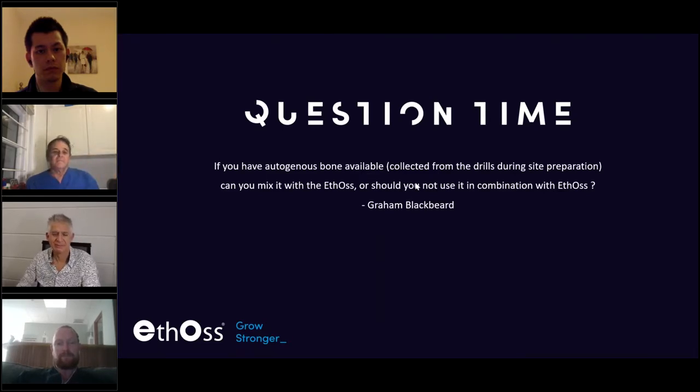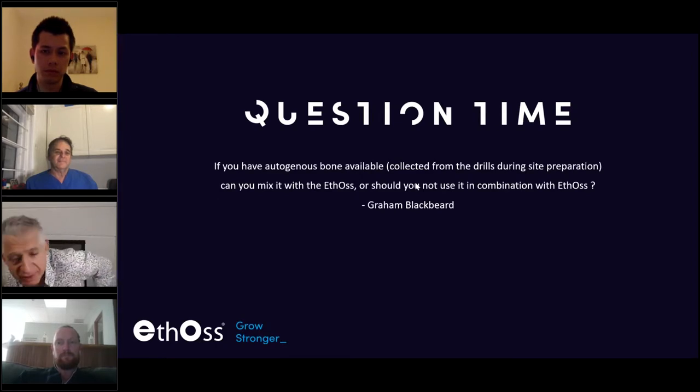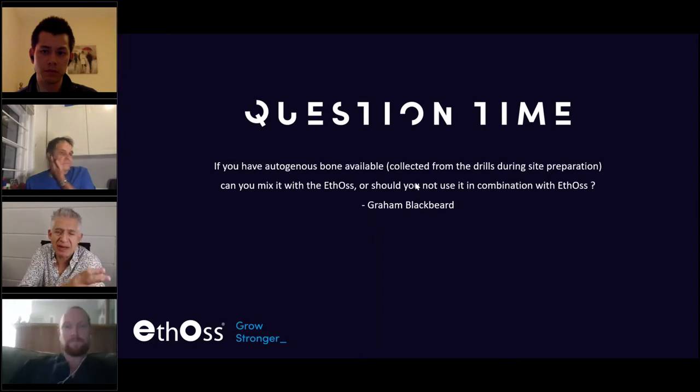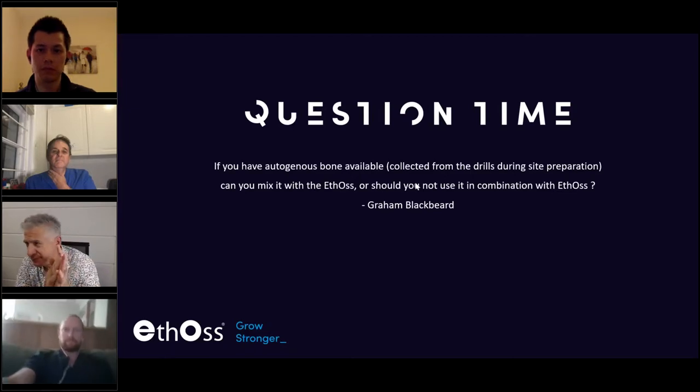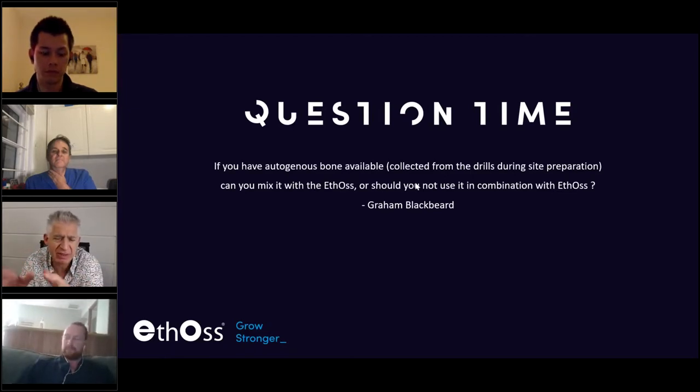So moving on to the next question. How many Newton centimeters would you require to load immediately? I think you were talking about this, Costa. How many Newton centimeters? Yes. It's interesting because if you go back to 2013, there was a consensus between Harvard and a couple of other universities. And there were guys there by the name of H.P. Weber and Papaspyridakos and a few other guys. And they were talking about 32 Newton centimeters, which by today's standards is totally inadequate.